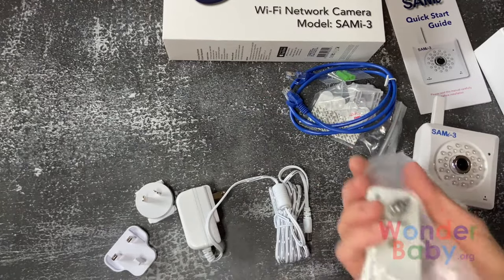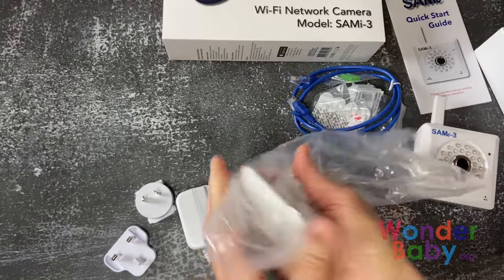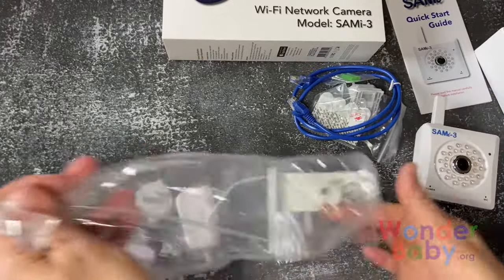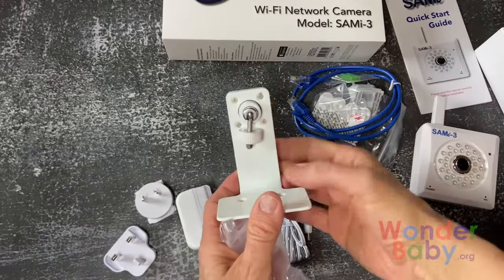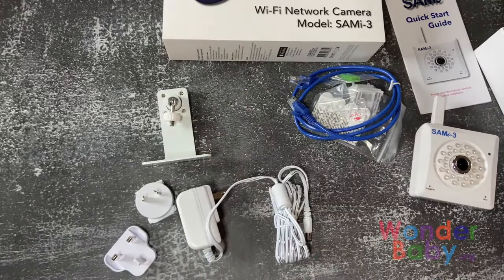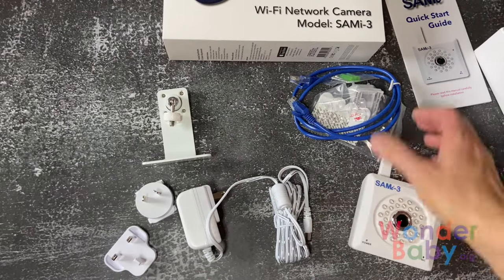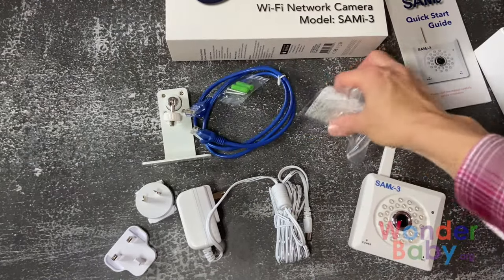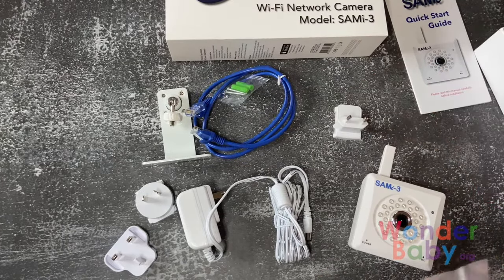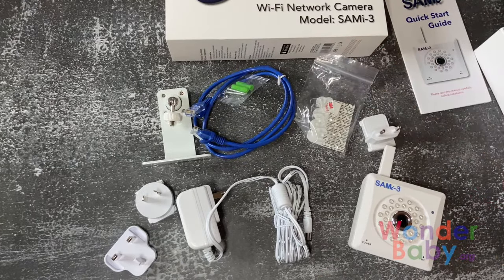This is the camera bracket. I actually really like the design of this. It's really easy to install — you can put it on a wall. We put it on my son's bed frame and then it just screws right into the back of the camera, so it's really easy to use. That's the Ethernet cable, and that's everything you need to set up your monitor.